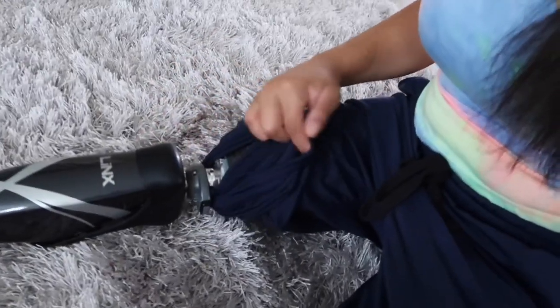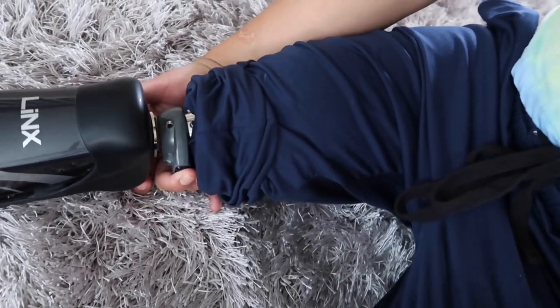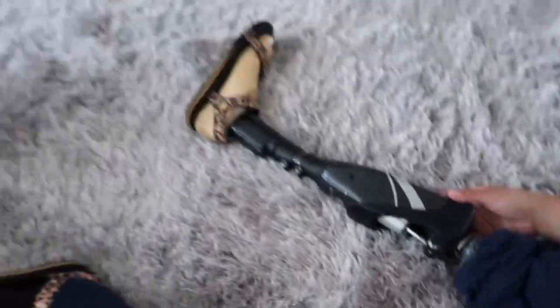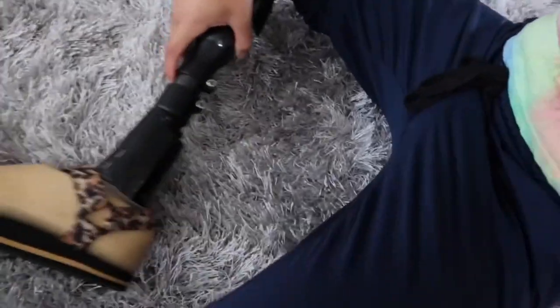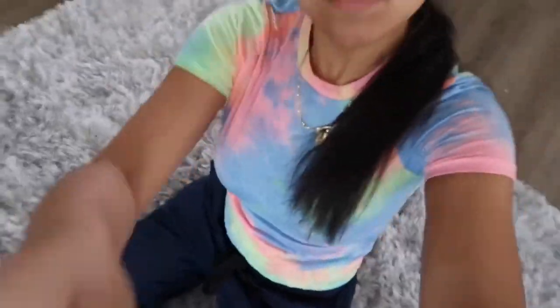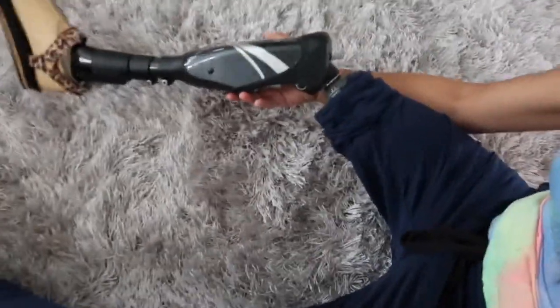So I'll hit this rotator, which is this gray part right here. I'll press the black button to rotate it. So you see how it basically falls to the side? Then I'll just grab the leg and put it however I like. Sometimes I like to sit crisscross applesauce. For some reason this is more comfortable to me when I'm sitting on the floor, because my socket will be pushed to the side a little bit and it makes it a lot more comfortable.